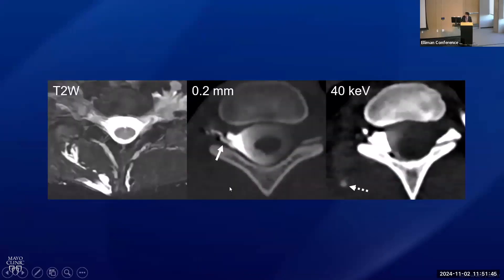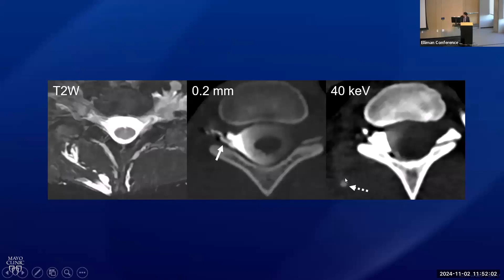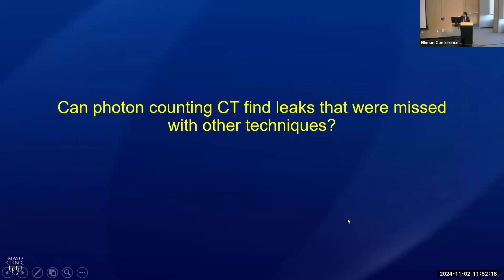Here's another example — a young woman with a paraspinal venous malformation visible on MRI. Sometimes these congenital venous malformations next to the spine can actually cause CSF venous fistulas to occur. On the high-resolution image we could see the fistula pretty well, but it was only on the spectral imaging with brightened contrast that I could see contrast going into the venous malformation itself. That confirmed the venous malformation was causing the fistula, and that affected how we treated this patient.